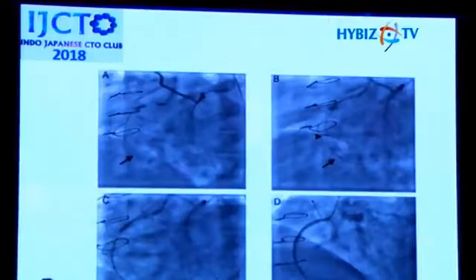Then they changed to a Stingray balloon catheter, but again with the monorail balloon here, it did not help. Again the subintimal hematoma increased, probably because of seepage of blood, and then they had to put in an OTW balloon again, continue aspirating the accumulated blood, and finally they could get the distal true lumen and complete the procedure.